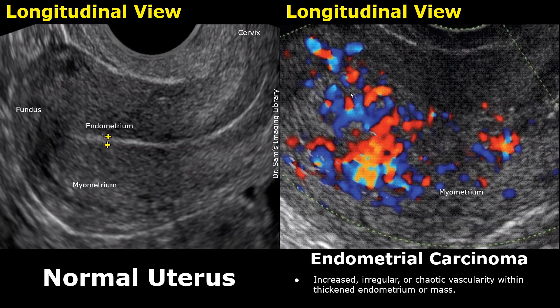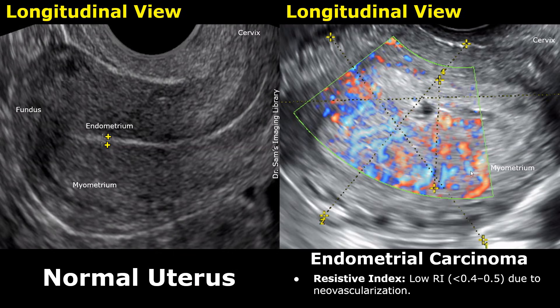On color Doppler, there is increased irregular or chaotic vascularity within the thickened endometrium or mass. This increased chaotic blood flow is another indicator of likely endometrial carcinoma. On spectral Doppler, if we calculate the resistive index of this flow, it will be below 0.4 or 0.5 for increased vascularity related to endometrial carcinoma.